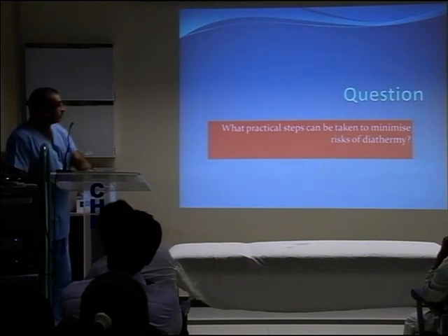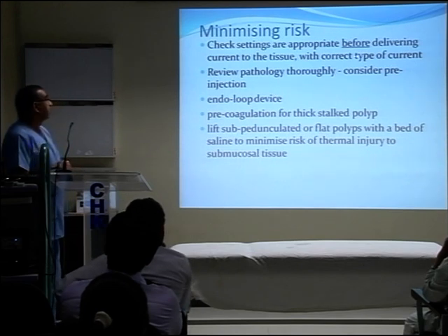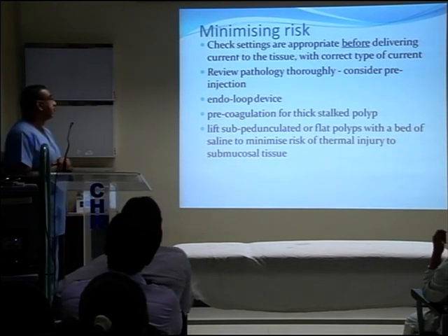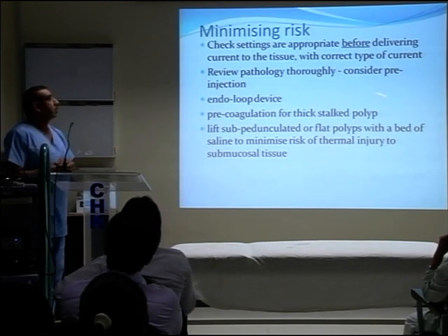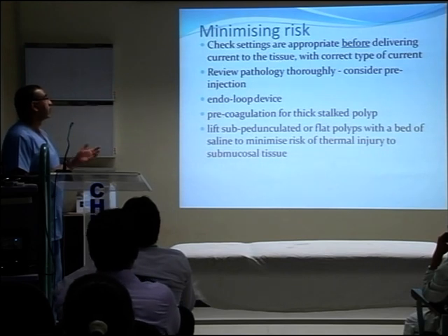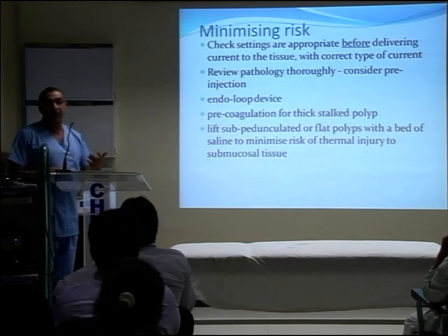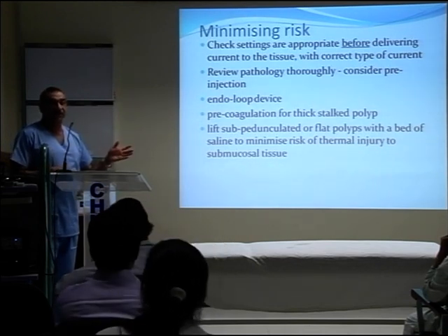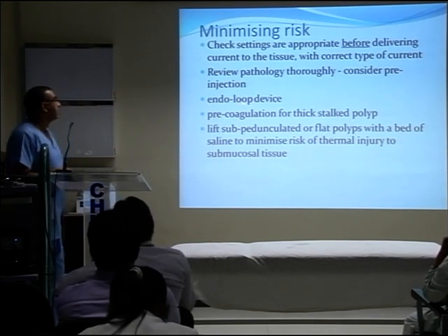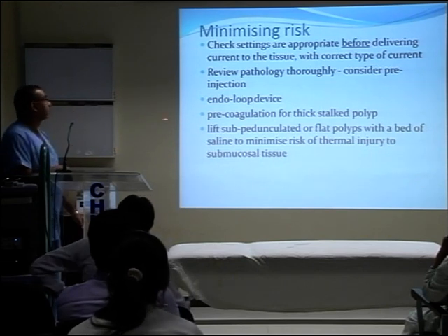So what steps can you take to minimize the risk with diathermy? Number one, before you use any machine, you should be familiar with its settings. I remember I went to Paul's department and they had bought the new machine, and a lot of them were having problems with it because it had never been demonstrated. We were using exactly the same machine, but the rep from the company came and spent almost half a day with each of the consultants and taught us how to do it. So I think it is very important that whatever machine you use, you read the literature about it and you know how to work it.